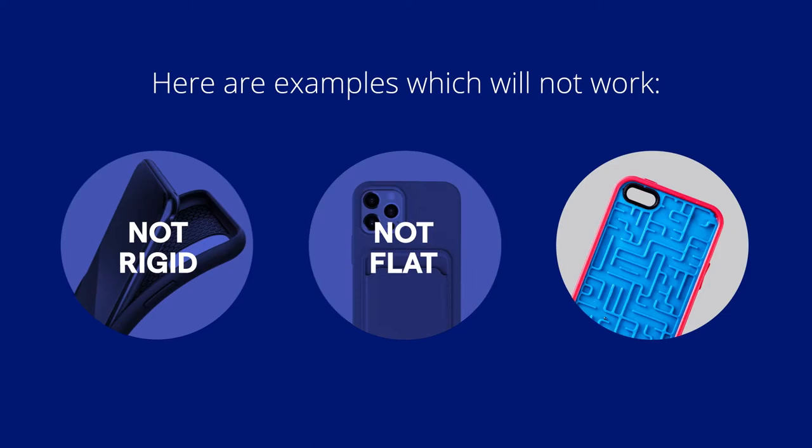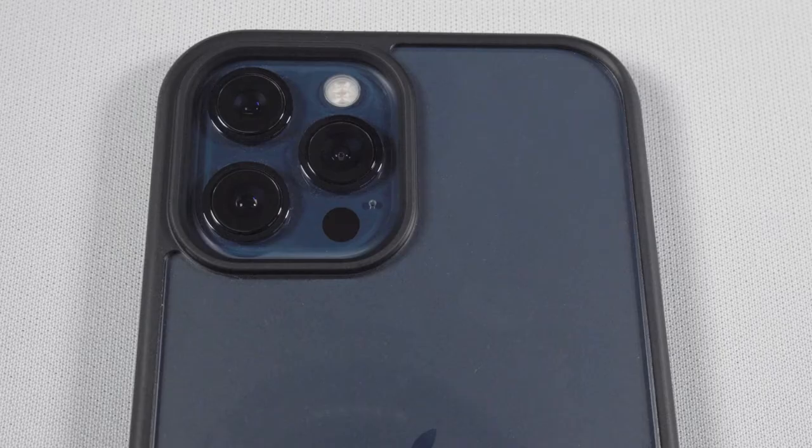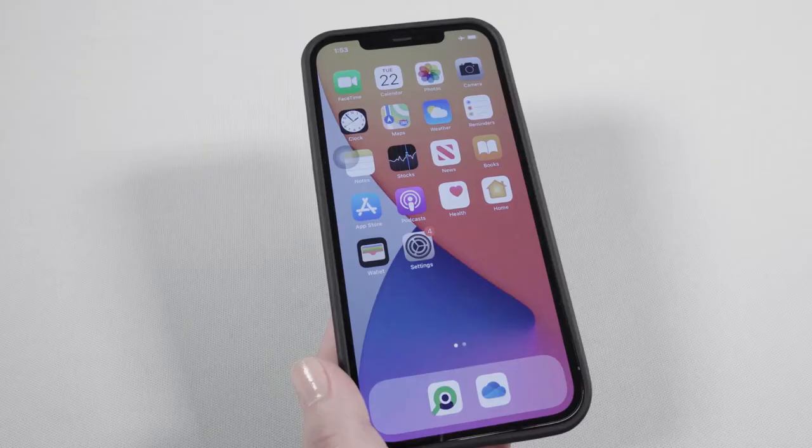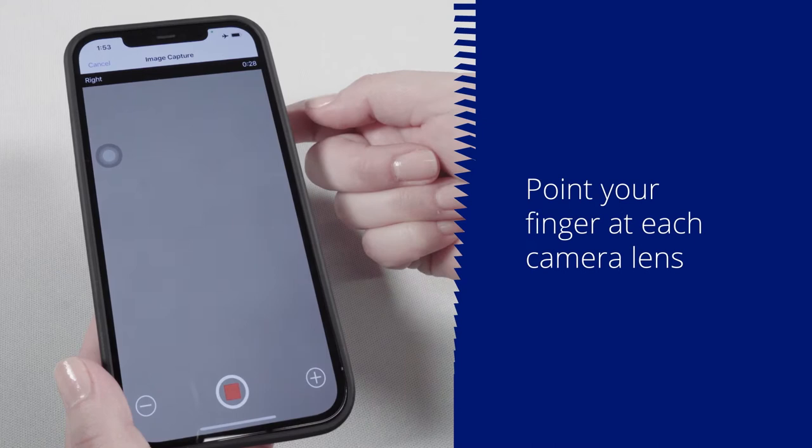It is important to align the smart bracket with the primary camera lens. Your smart device may have more than one camera lens. To determine which camera lens is the primary lens, open the iExaminer Pro app and point your finger at each camera lens. While looking at the screen, you'll be able to determine which lens is primary. This is the lens to align your smart bracket with.